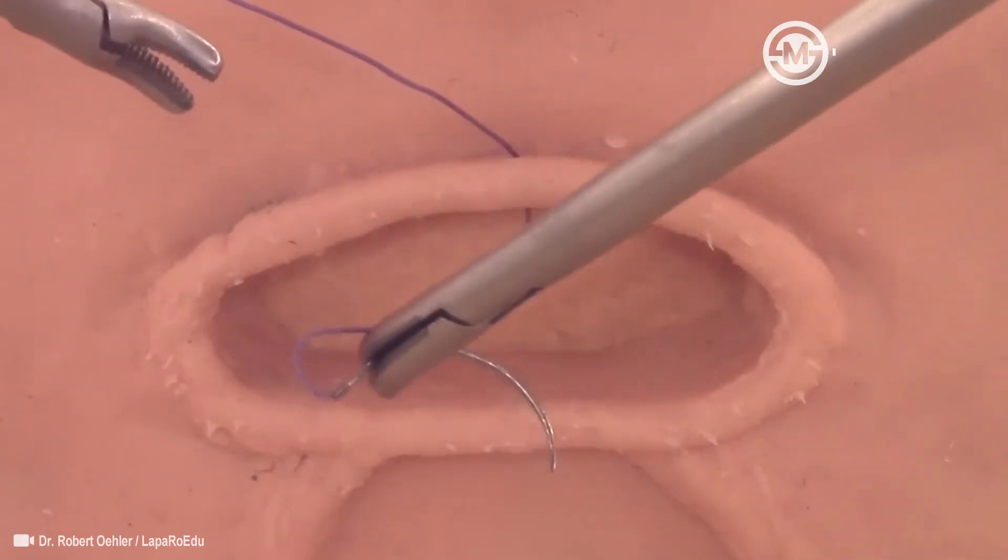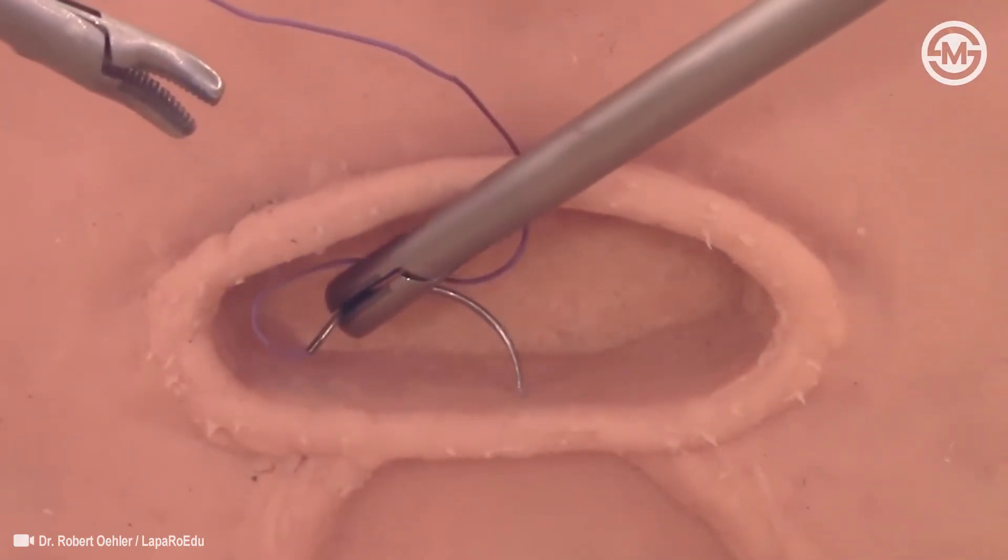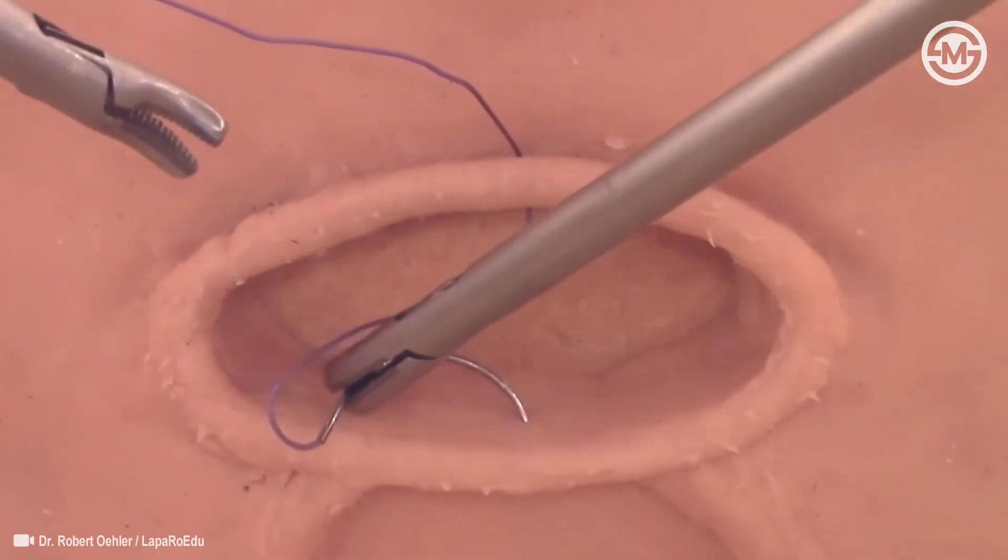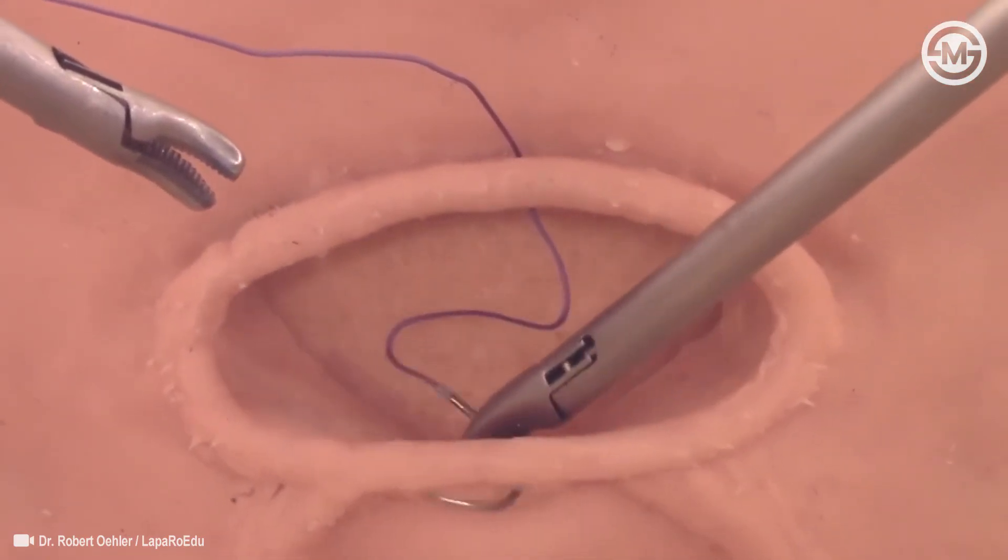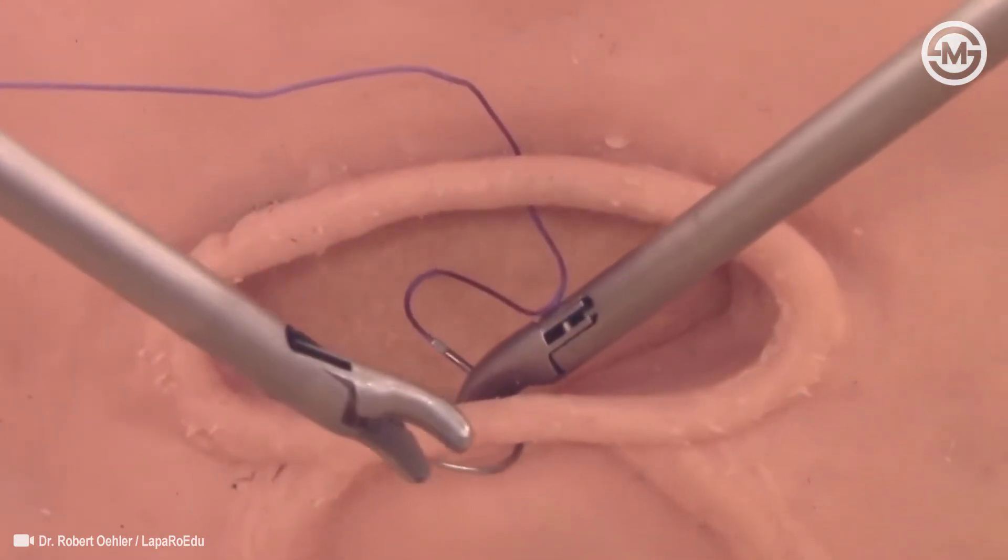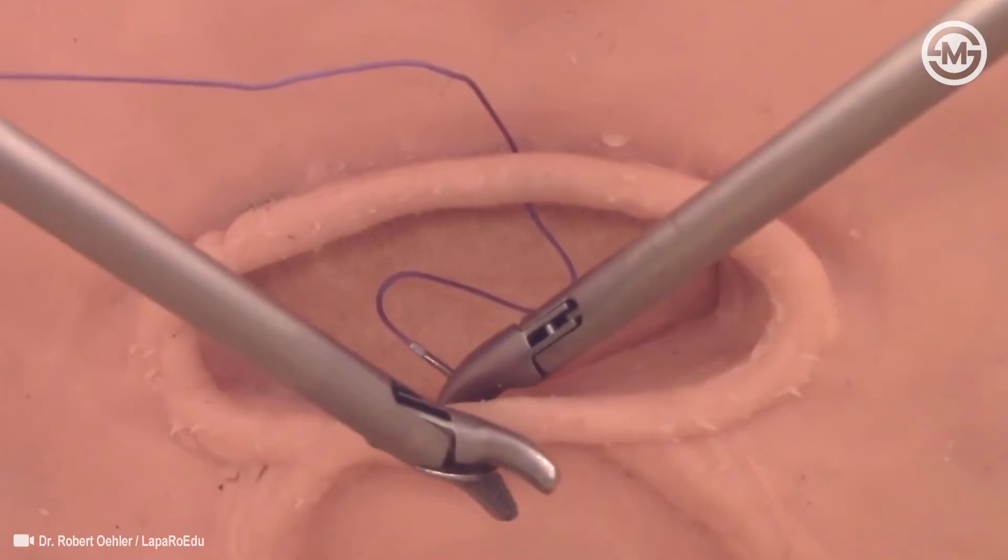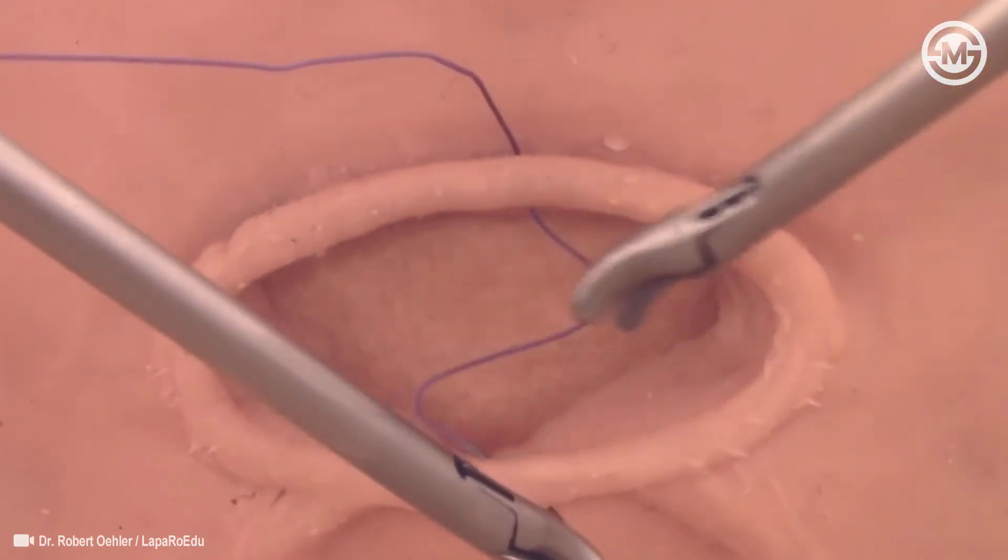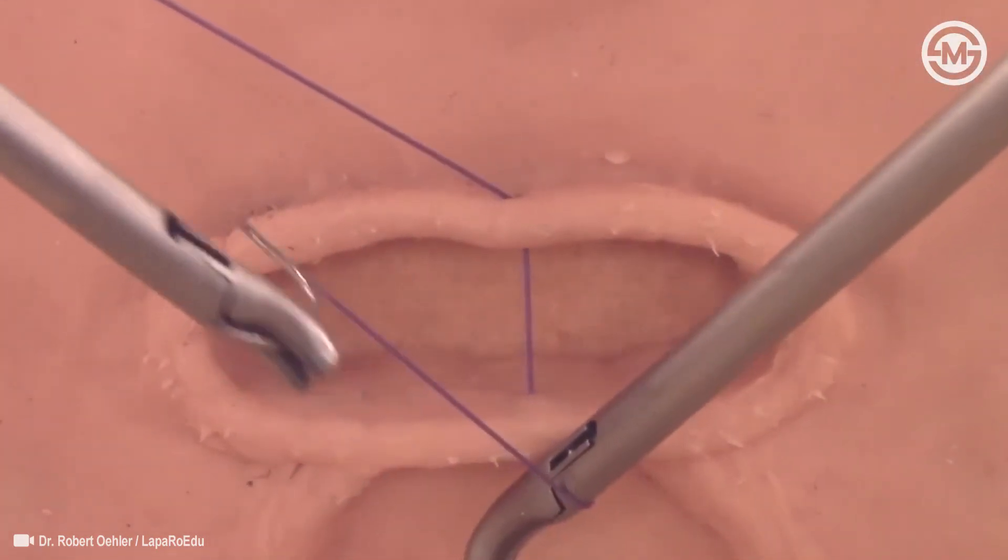The second stitch is made just like the first one, by advancing and rotating the needle driver, creating a transmural stitch with its entry point in the posterior vaginal skin. Again, the left needle holder takes the needle in the shown position with a firm grip and completes the stitch.